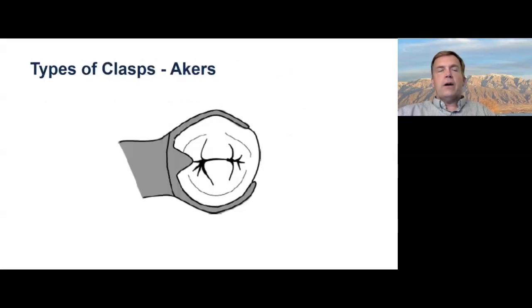So thinking about the different kinds of clasping, this is the Akers clasp. I think in a lot of ways, this is kind of the Swiss Army knife of clasps. You see this all over the place. It's a good go-to. They're simple, they're versatile. The main disadvantage to them is if we're using a metal partial, they tend to have a lot of display, so it's easier to put them in the posterior.